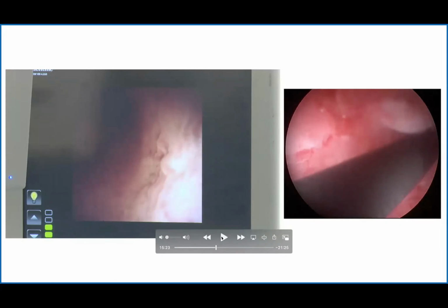So we've got a couple of comments which I really want to just mention. So Mike Kellett has said, "I admire your minimal tracks. Good to see all Wickham did to start minimal intrarenal surgery," which is nice. And then Graham's asked, do you agree that smaller track makes for less bleeding, and that this is important when doing a combined FIRS PCNL? So do you want to talk just a little bit about the track size and minimization, and when you might maybe do a mini, or what sort of track size you're using here?